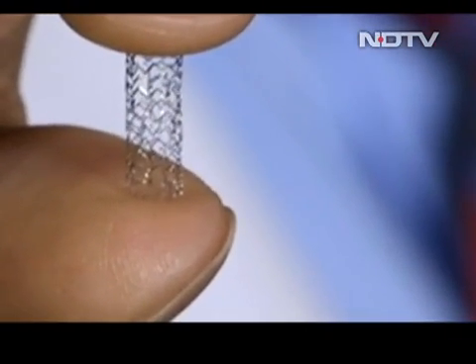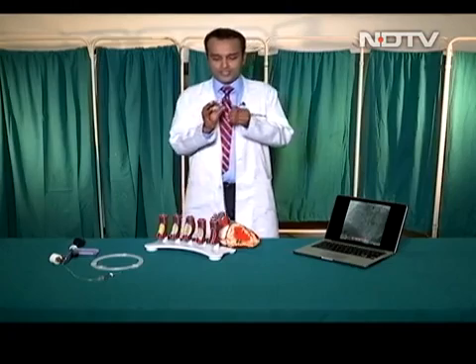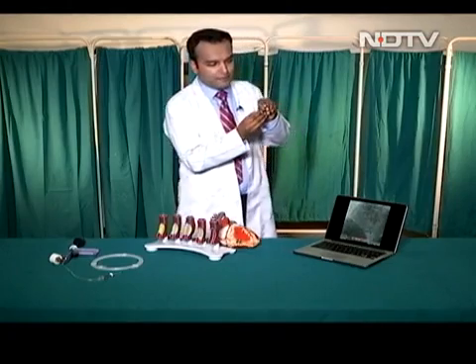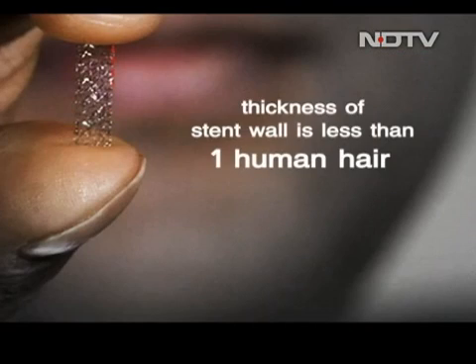Now, what is a stent, you may ask? A simple way to think of a stent is like a spring in a ballpoint pen. These stents are very thin. In fact, the thickness of a stent is less than that of one human hair.